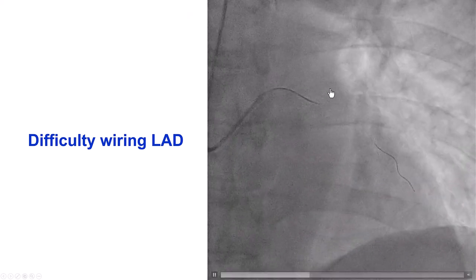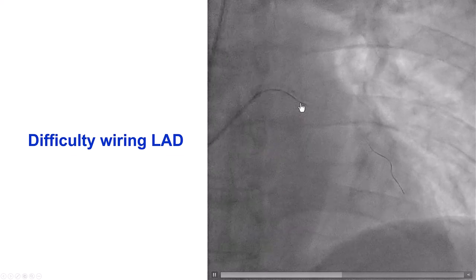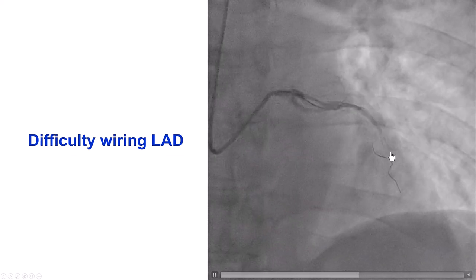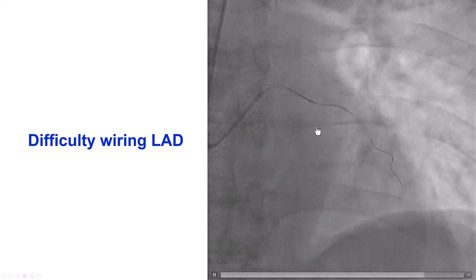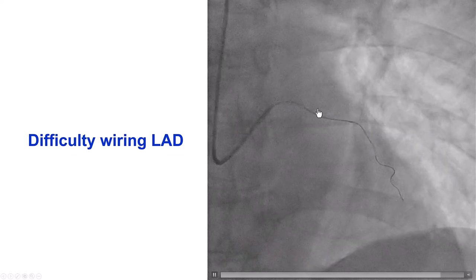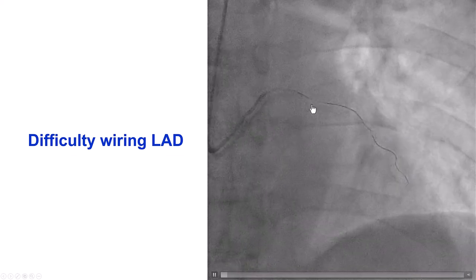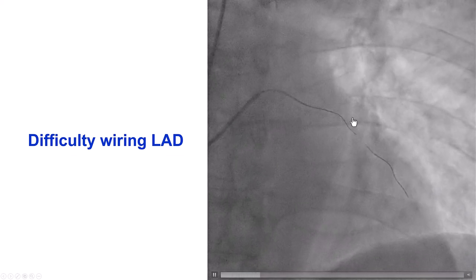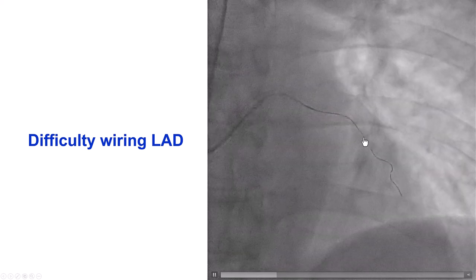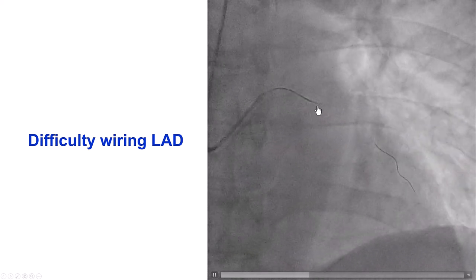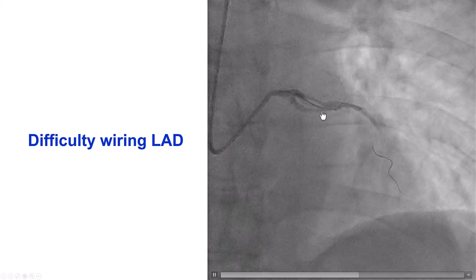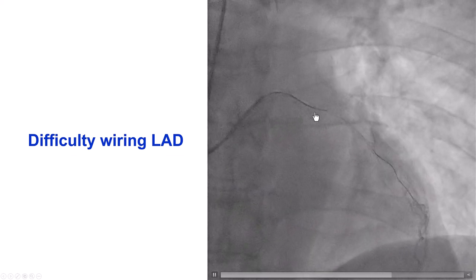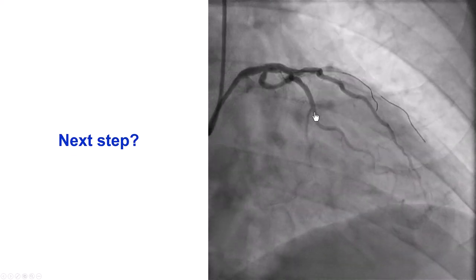The plan was to perform percutaneous coronary intervention of this lesion, so we advanced a guidewire that went easily into the diagonal branch. However, we did have significant difficulty advancing various guidewires into the LAD. All the guidewires wanted to go into the diagonal. This happened despite using a microcatheter — this is a Corsair — and despite using various guidewires including SUO3 and a Sion Black.